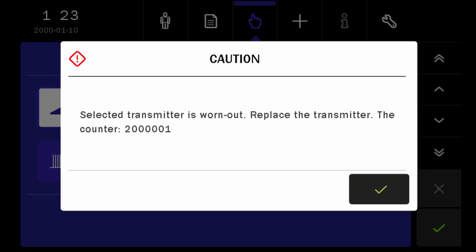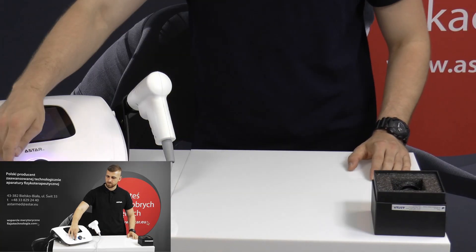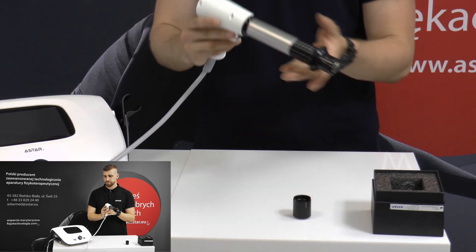After reaching 2 million shocks, disconnect the device from the main supply, unscrew the old transmitter and install a new one, tightening it until it stops.